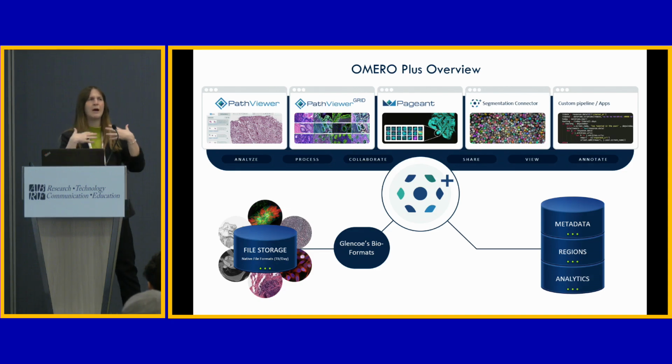But remember, this is all about the sort of analyze, share, collaborate, all those activities that we've described since the beginning. So PathViewer and PathViewer Grid are digital pathology focused interfaces, tools for viewing and annotating large whole slide images. Pageant is a data mining tool, so things like spatial transcriptomics or single cell segmentation or any kind of segmentation.